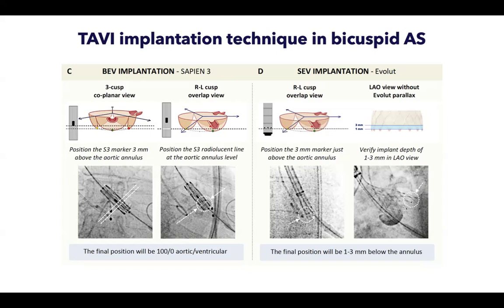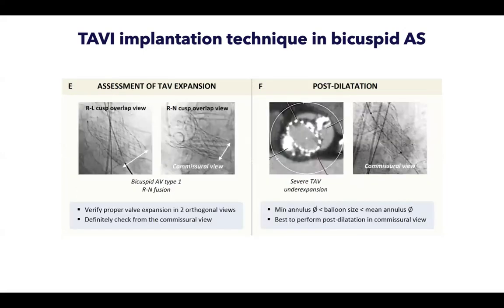If you do that, you really risk that the valve will dive into the LVOT and you're implanting too low, and you can risk a supra-skirt leak. Then it's important, if you've done your implant, I will always screen for valve expansion.